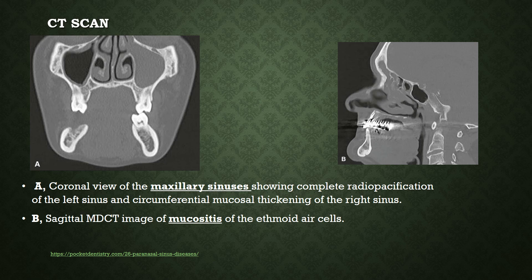This CT scan of the maxillary sinus shows a coronal view in picture A with complete opacification of the left sinus and circumferential mucosal thickening of the right sinus. Picture B is a sagittal view of a multi-detector CT scan showing mucositis in the ethmoidal region or ethmoidal air cells.